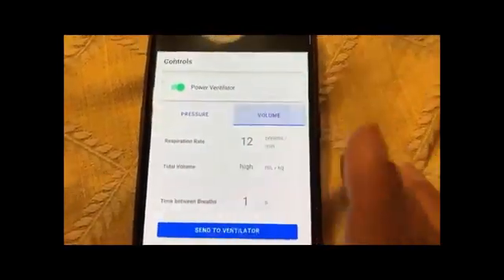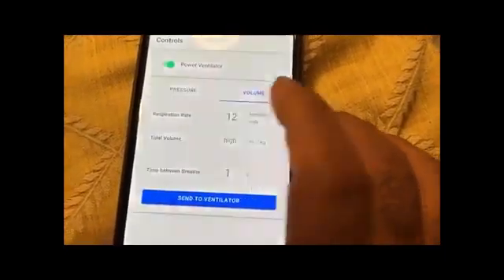For example, if I want to set it for a child or an infant, if I set the respiration rate to 20 and send it to the ventilator, you can see that it went faster. It is not an onboard computer — it can be connected to a phone, and accordingly all the parameters can be controlled.